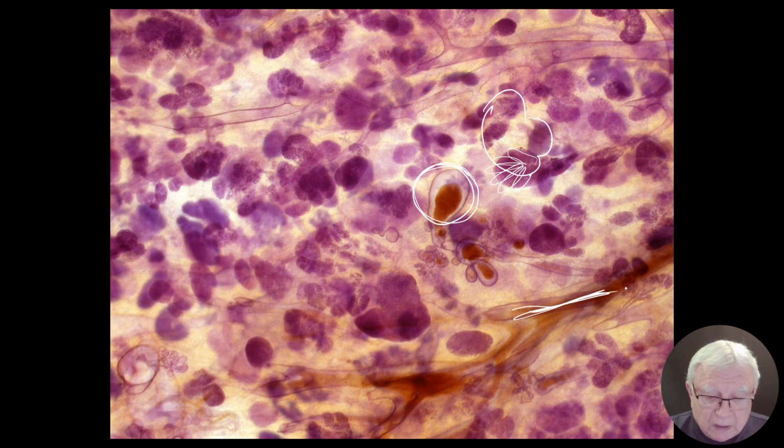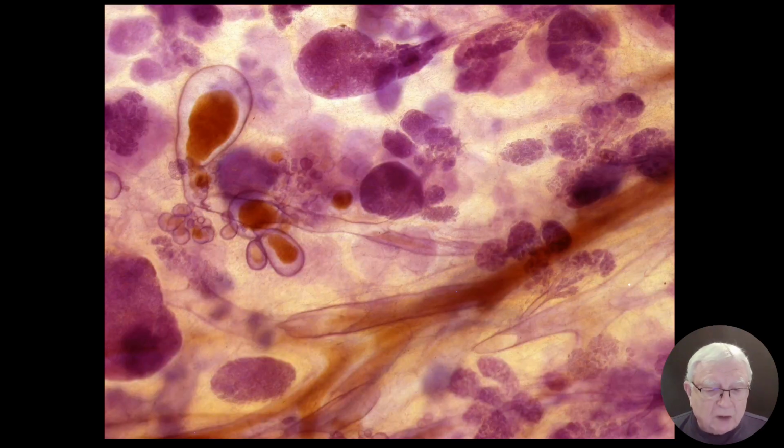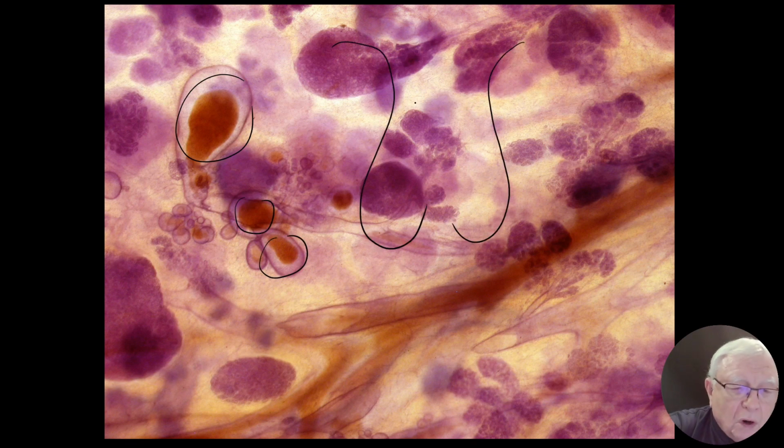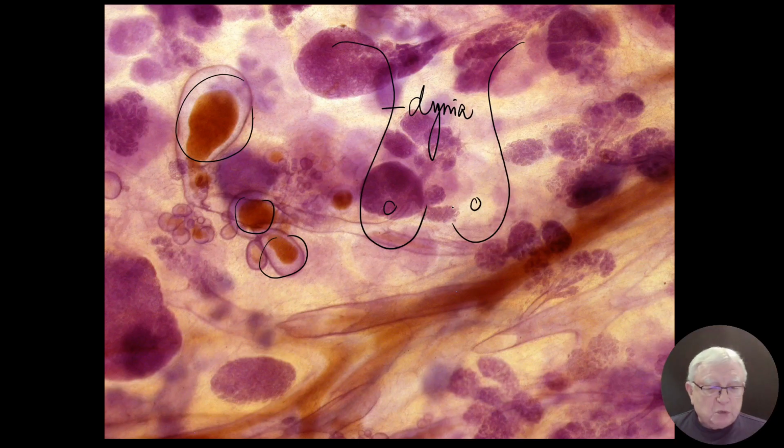Here is the fluid in the subsegmental duct. Enjoy looking at this. Radiologists, when they're performing ultrasound, can see these small holes, hundreds and hundreds of, at women who come with mastodynia. And I'm sure that the colleagues, the surgeons, are very much bothered by the complaint. Breast pain. This is one of the most frequent so-called diseases in the world.